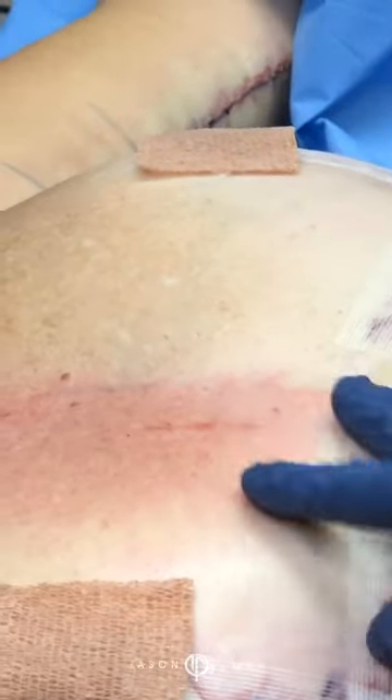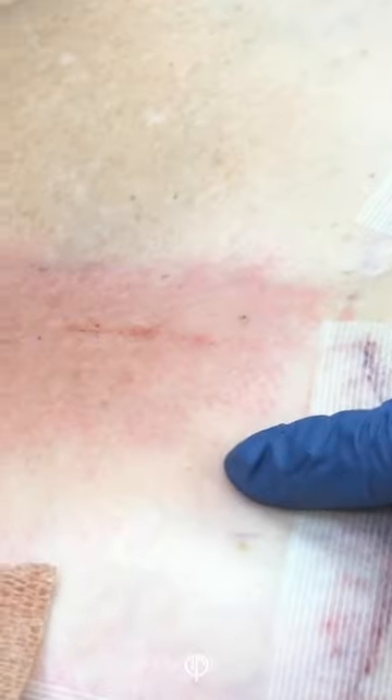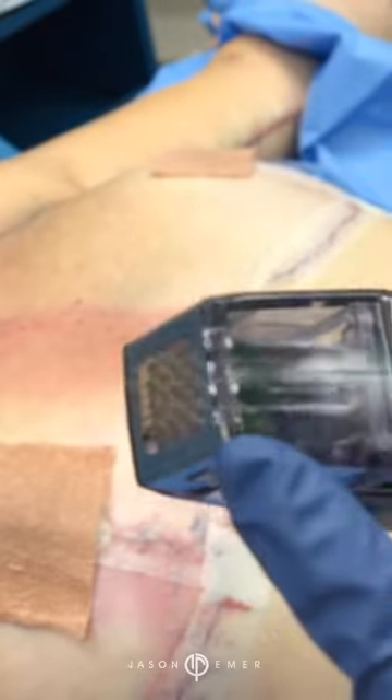You can see her skin response in the area that I've already started working. The redness is a sign of tissue response to the heat. If you're able to get close enough, you can see the texture here. It looks like some little pins in the skin — you push it into the skin, it delivers its energy, and you see the imprint of the needling.